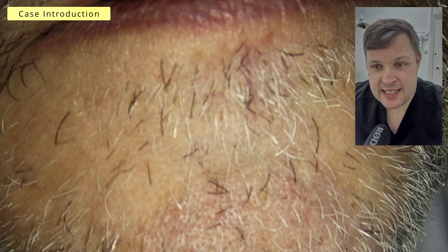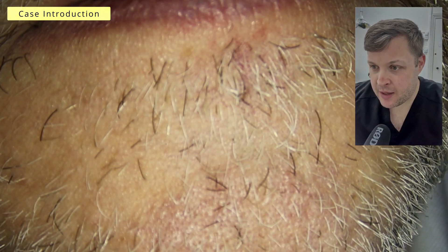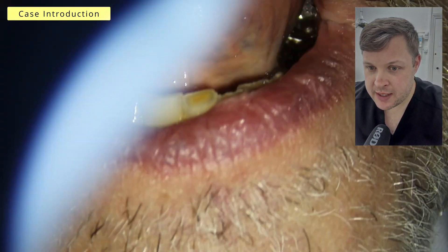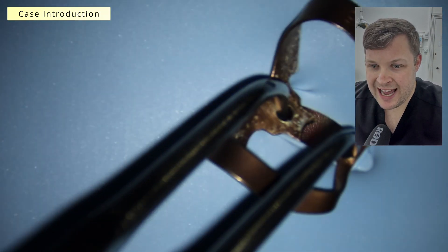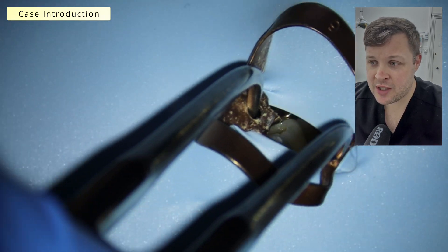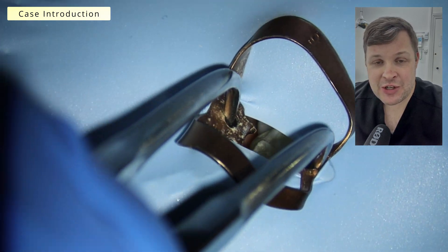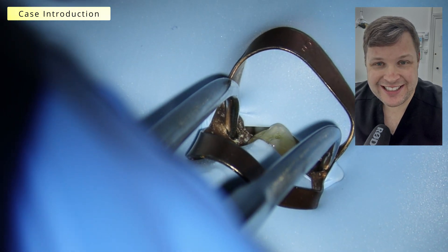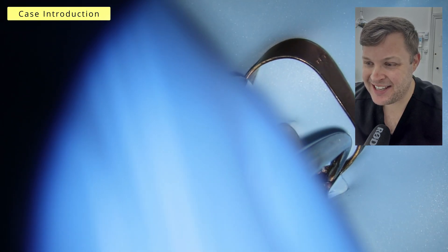Hello, welcome today. This is a video about a root canal where the access cavity wasn't as traditional as you'd like to think.